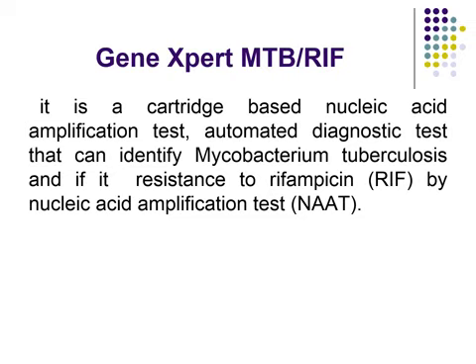Rapid antibiotic sensitivity test. It is used to contribute to the rapid diagnosis of TB disease and drug resistance at the same time.